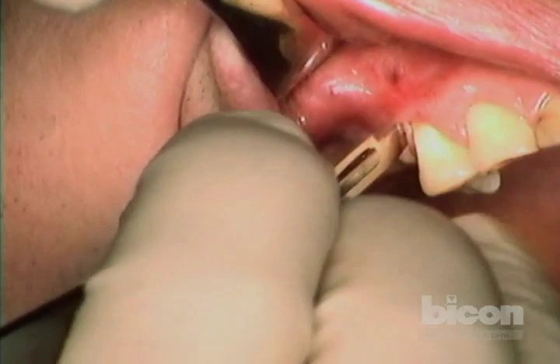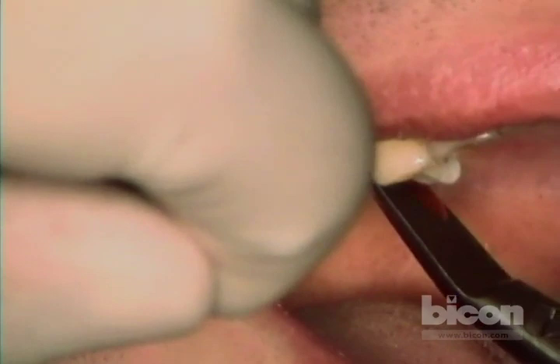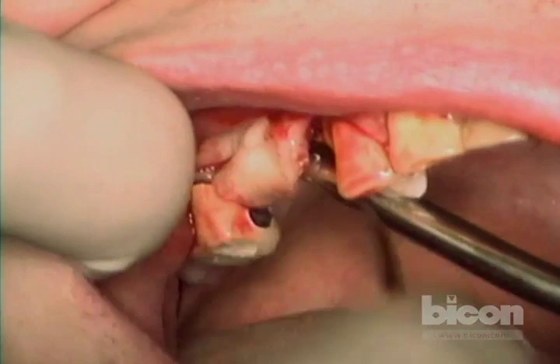I don't like angles and connecting lines. I'll use a little blunt dissection to see where the flap is lifting or not, then I'll take a periosteal elevator and peel it back.